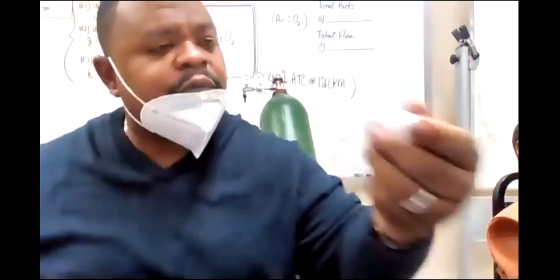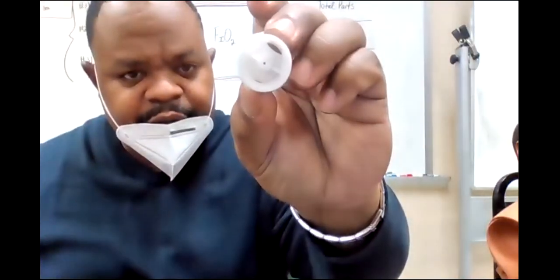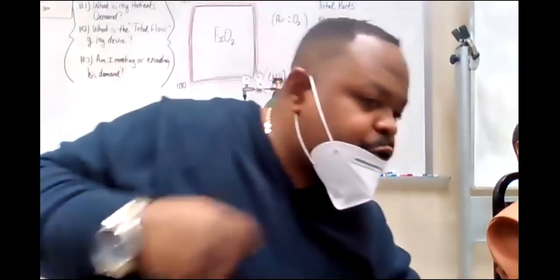Now, and then the white one, of course, is 31%. See, a little bit bigger than the 24, the 28. And it's 31%, you can't see that one, but that's the white one. Now, with these, you have to have one piece of large bore tubing. All right, so if I'm making one myself, I use one of these.